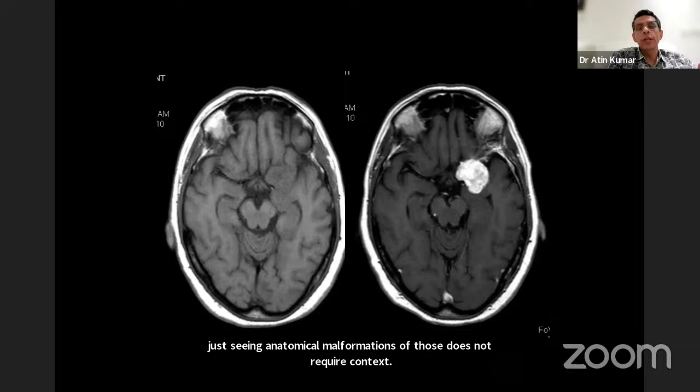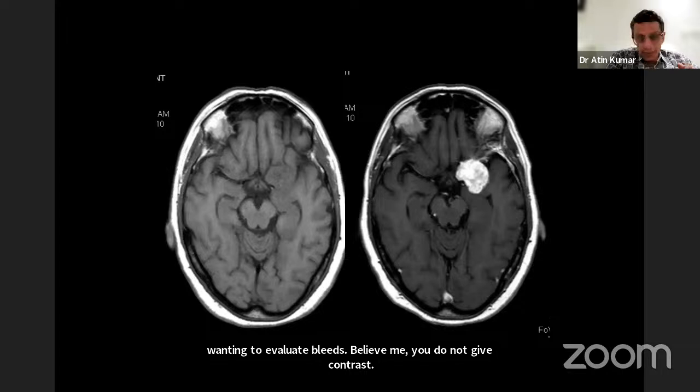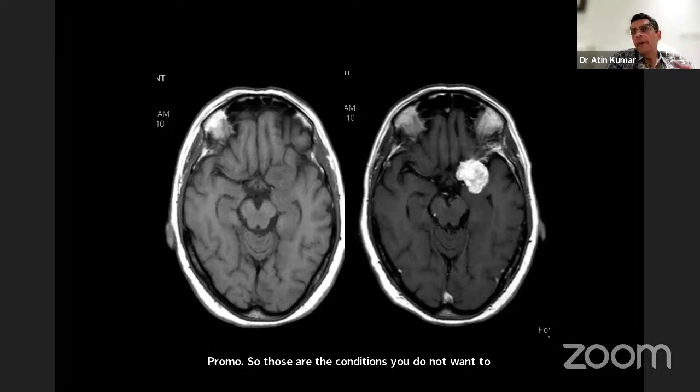You do not want to give contrast when you are just wanting to evaluate bleeds. You do not give contrast when you have suspicion of calcification. You do not give contrast when you are just suspecting trauma. Those are the conditions where you do not want to give contrast. Even for most of the metabolic disorders, even if you're suspecting one, you do not want to give contrast.